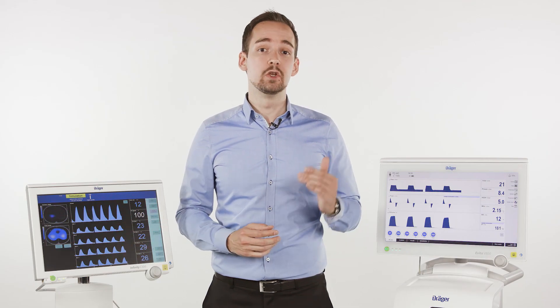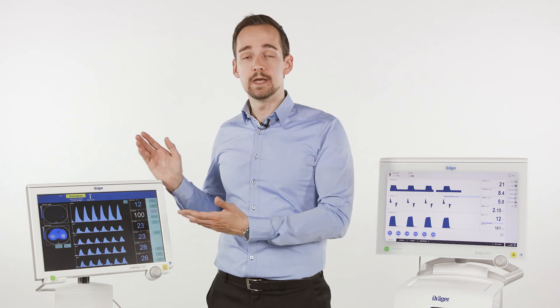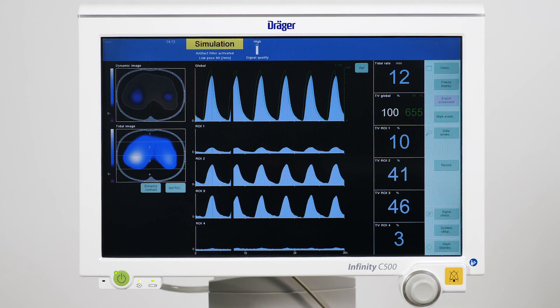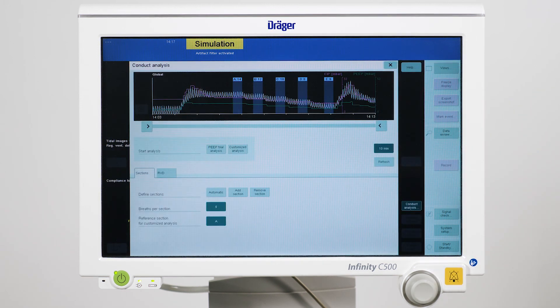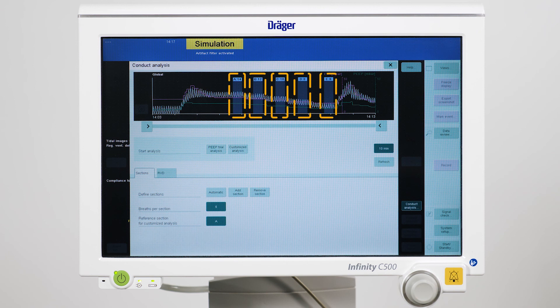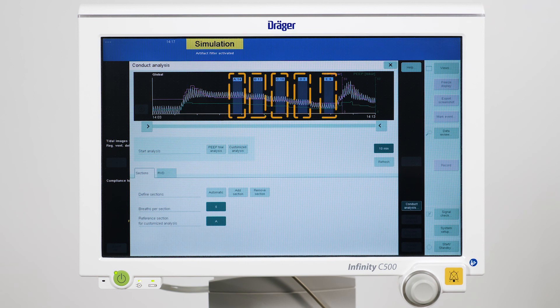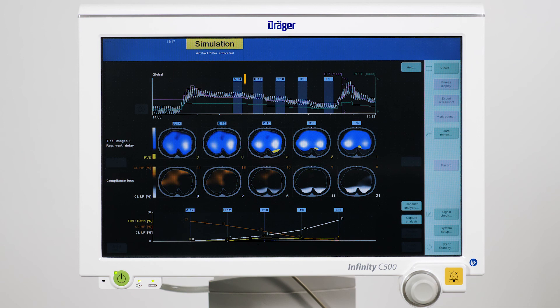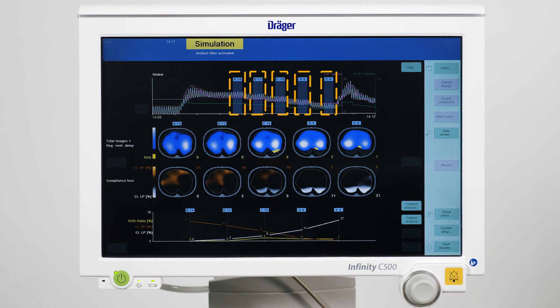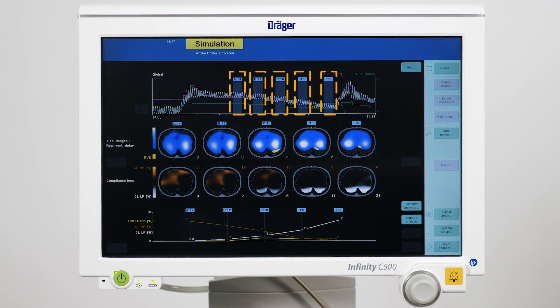After performing the diagnostic maneuver, we use POMOVISTA to analyze the PEEP trial. Here we open the diagnostic view. We use the start page to define analysis sections for each step of the trial. These sections are usually found automatically by the built-in algorithm. Now we simply press the button PEEP trial analysis. The results of the PEEP trial analysis show an overview of the selected PEEP levels and the possible adverse effects of ventilation.